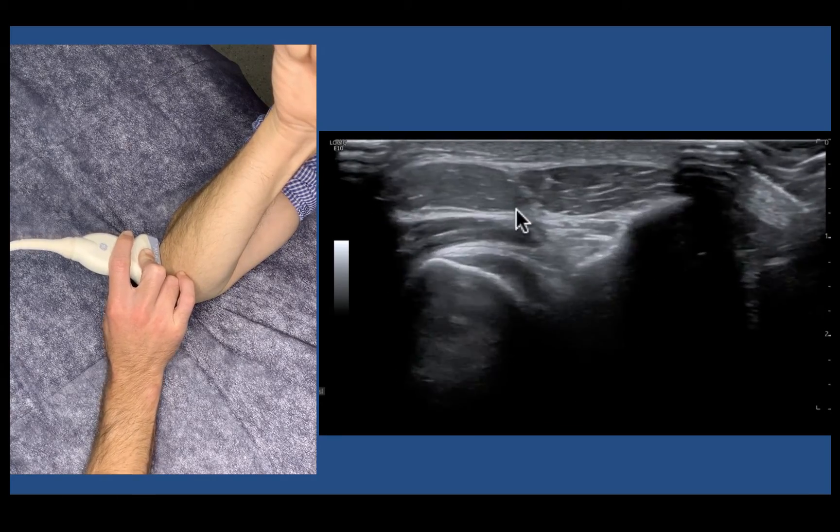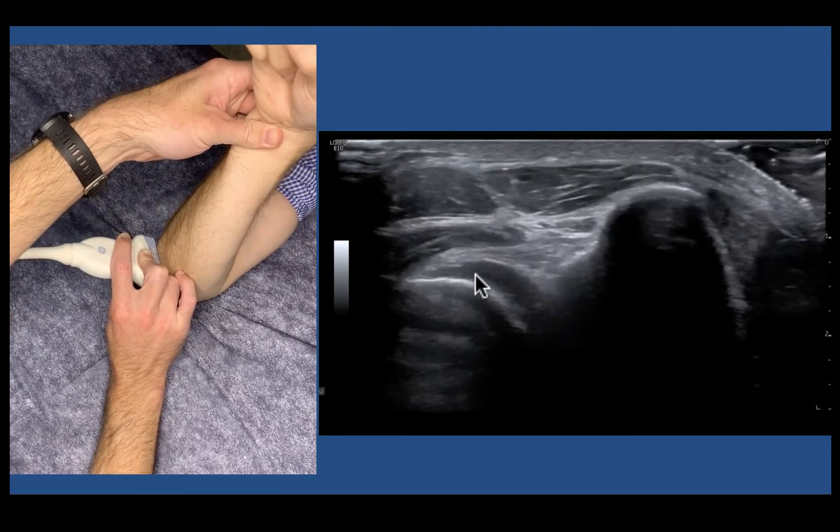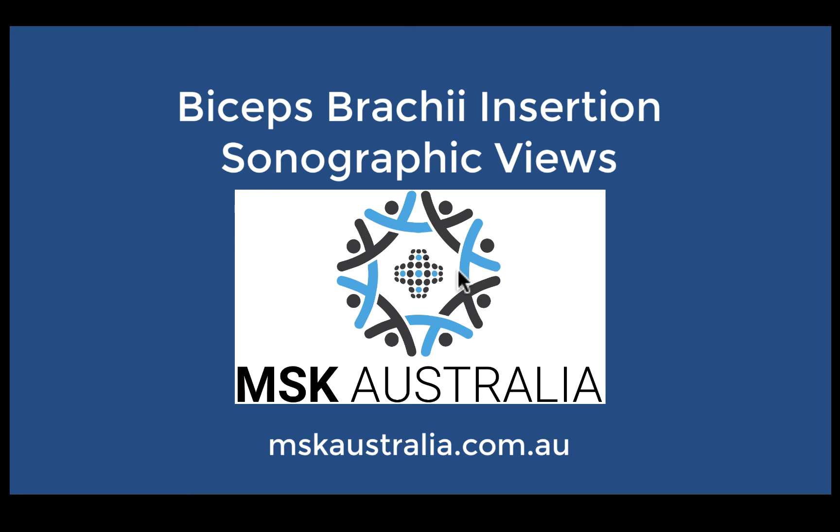As we fan through — fan up and down — to some degree we can differentiate the heads, but it's nowhere near as nice. It's slightly underwhelming, but you can see enthesis-based pathology. I hope this explanation has helped, and I hope you can add these scan techniques to your assessment and identify single head injuries of the biceps brachii tendon.